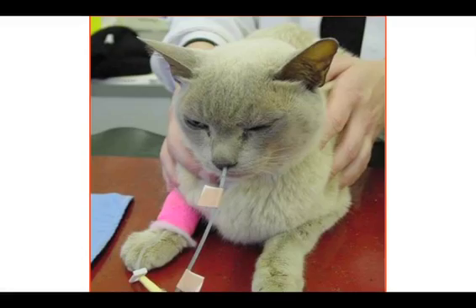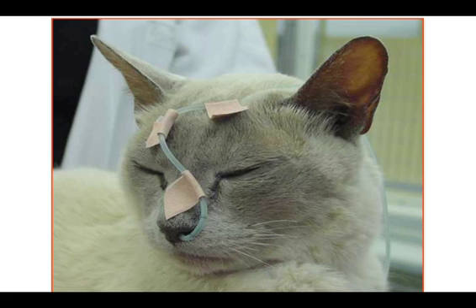Then we secure the tube — we put these little butterfly tape pieces on the tube where we're going to secure it to the cat's nose and the top of his or her head. Make sure you are quite in the middle of the nose so that it's not in their eye line too much. I would slightly criticise this image as having a little too much bandage and the tube being slightly in the cat's eye line — we want to try and avoid that.